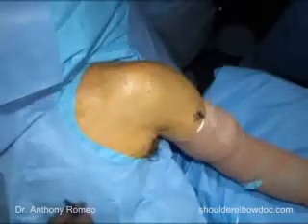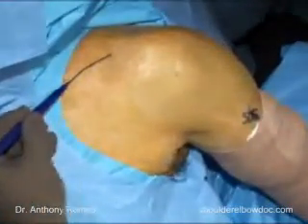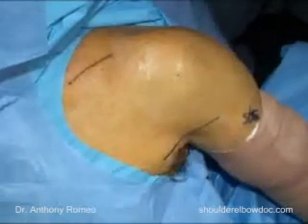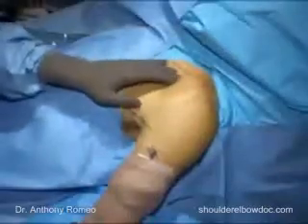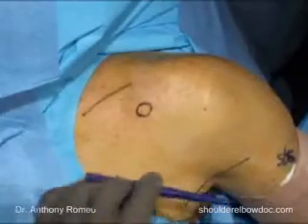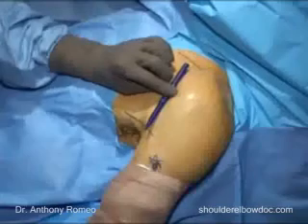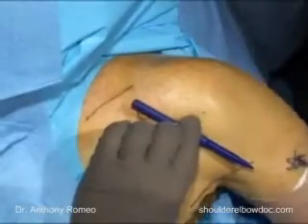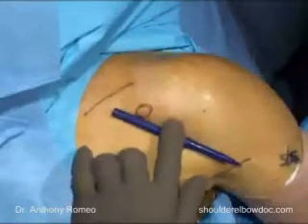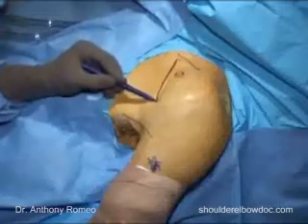Our approach is going to be a deltopectoral approach, and we have some standard landmarks. The upper part of our incision is along the clavicle, which we can palpate underneath the skin and mark. The lower part of our incision will be at the top of the axillary fold. The other useful landmark is the coracoid process, which we can palpate and this tells us where the deltopectoral interval is. The standard approach for many years was more of a vertical, slightly lateral approach, which is very good for exposure to the humerus; however, it does compromise exposure to the glenoid. So we start our skin incision moving it slightly medial, right in line with the deltopectoral interval, marked by the groove you can palpate, and we draw that line in preparation for our surgical procedure.